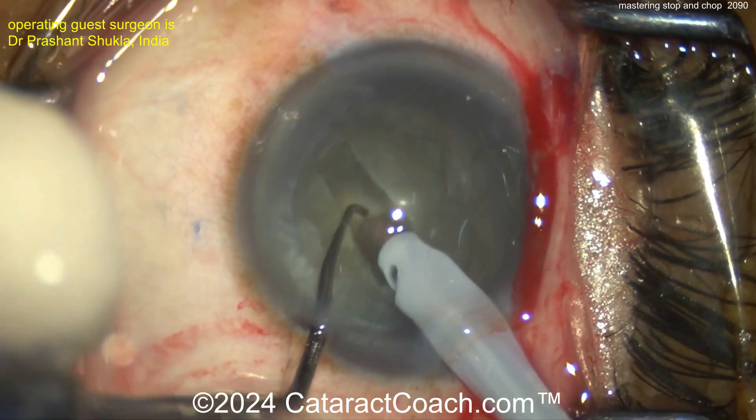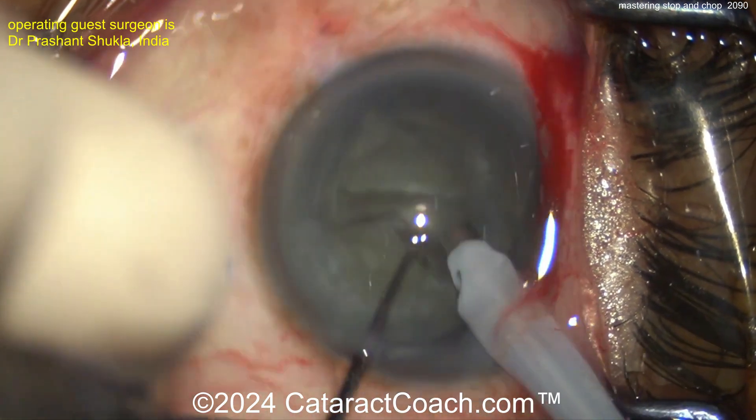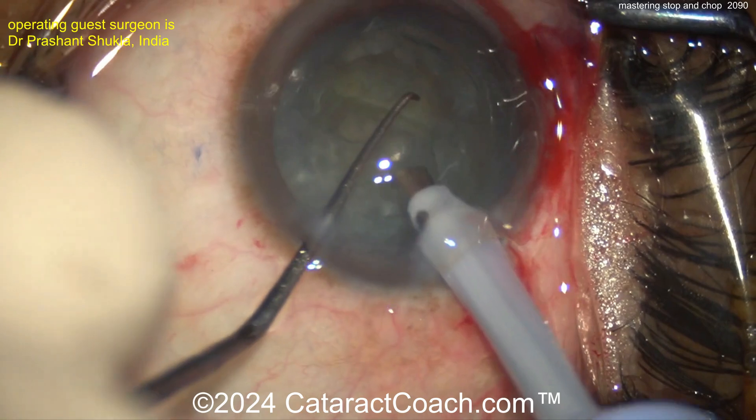After the groove is made, the chopper is going in here as well as the probe, and then just spreading apart. This is cracking into two halves, and then propagating that crack all the way through. It's important to get it through all the way.